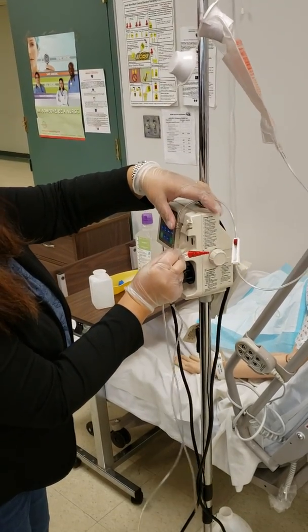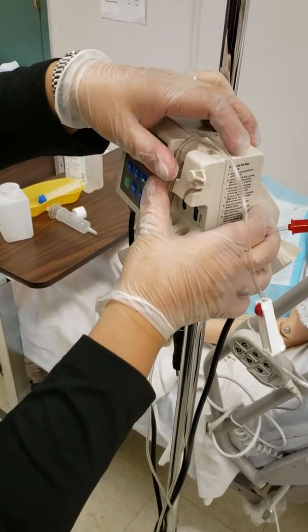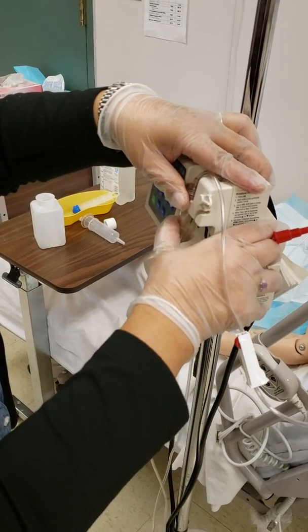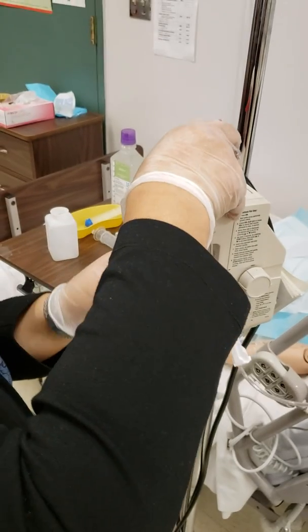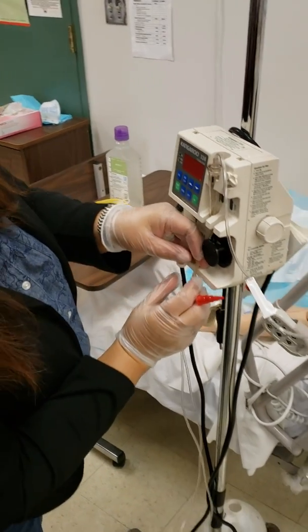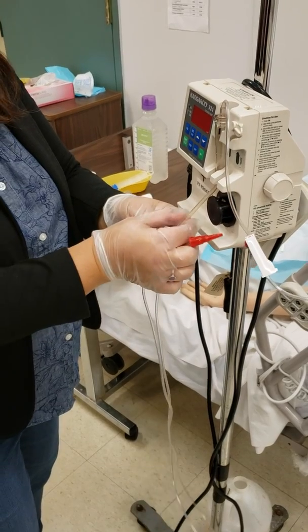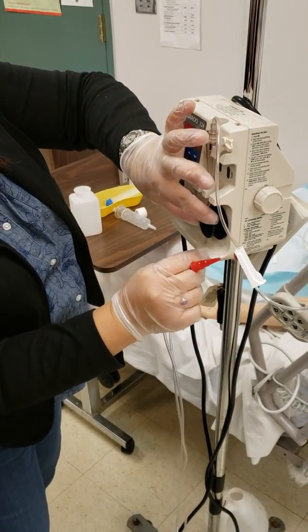So this goes here. Just push it like this. Right. I think it's better if you put it like this. Right. Yeah, that's the right way. And then this very soft membrane, you touch it, it's different. You have to coil this around here.